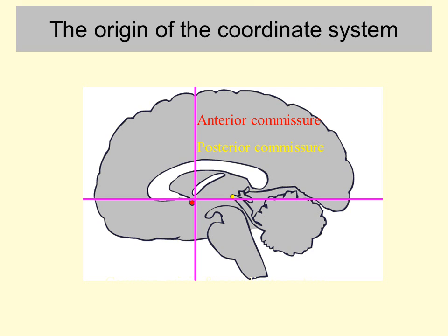So perhaps you could have a look at some images to see if you can learn to identify the anterior commissure.